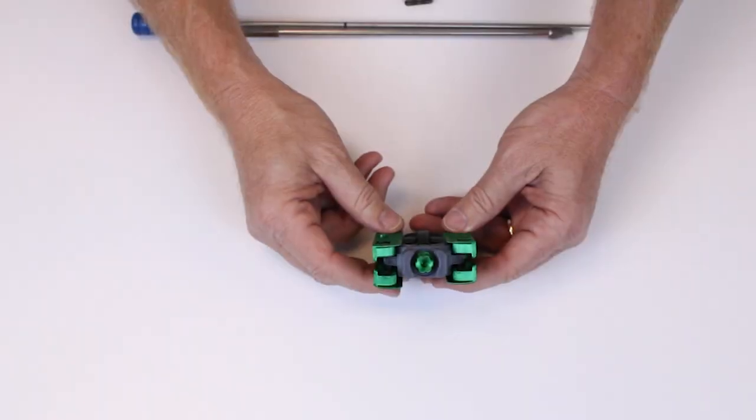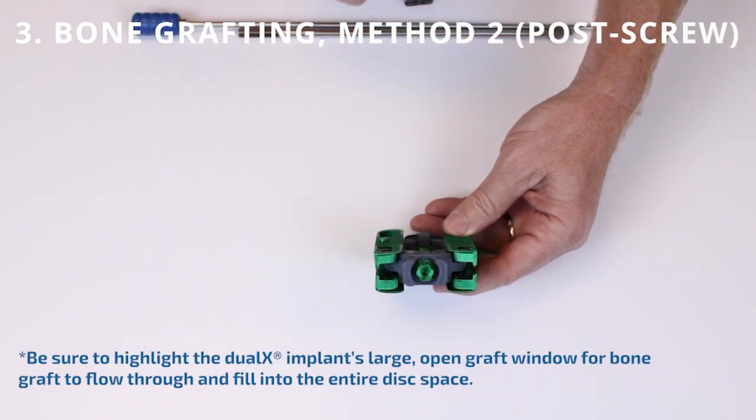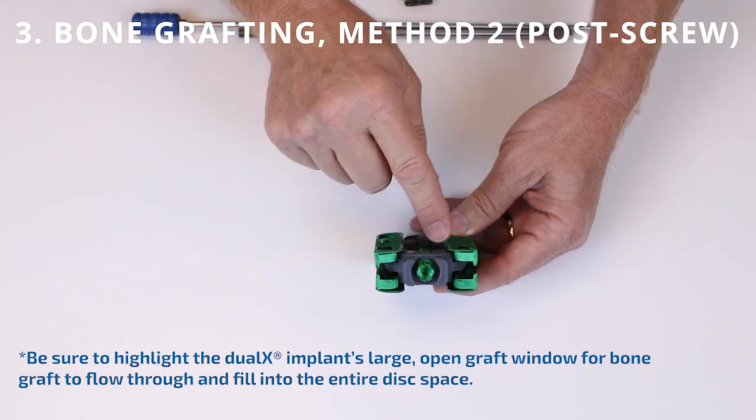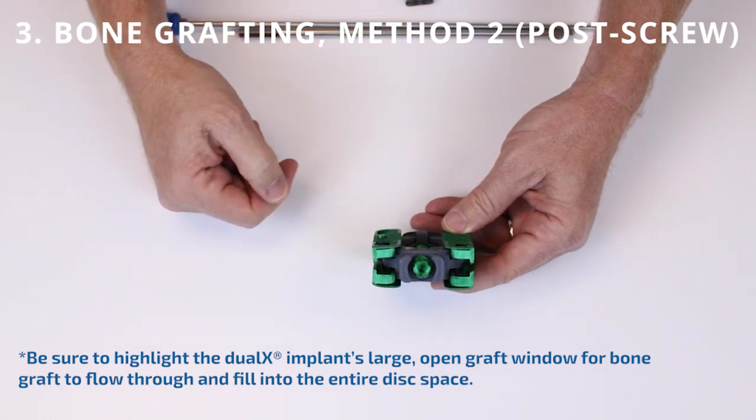The other method of bone grafting is to do so after the screw is delivered. The graft delivery tube with nozzle is designed to fit right in a recess above or below the lockout screw.